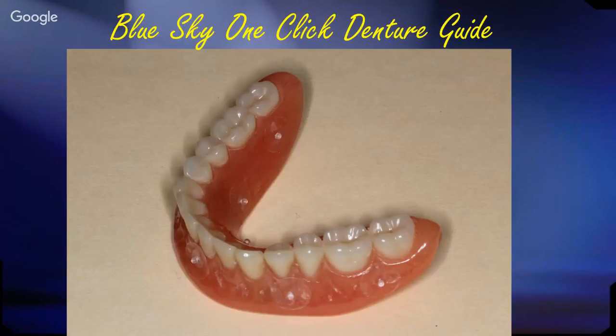Can I jump in with a question? Sure. Do you see any difference between a model scan plus DICOM versus 2 DICOMs with your inverted technique? We don't. Now, we have calibrated. There's a technique on calibrating it, and I believe Hiroshi Takagi out of Toronto developed that technique. It's an additional step. But once you do that once, if you use the same VPS material every time and the same settings to scan it on your CBCT, you should not have to do that calibration again. So Hiroshi has a video, I believe, on YouTube on how to do that one-time calibration as well.